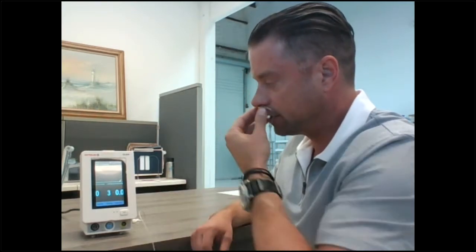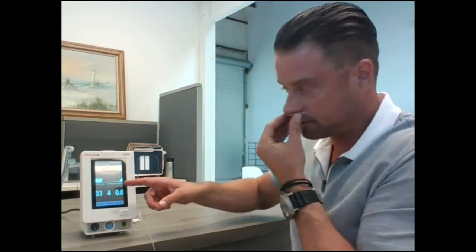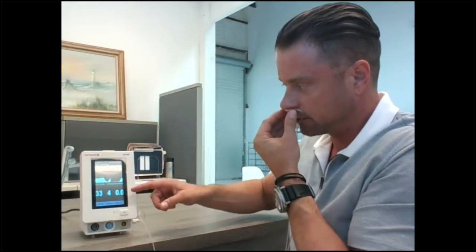Put the cannula on the patient and within a few seconds you'll start to see the waveform, respiration rate, and CO2.